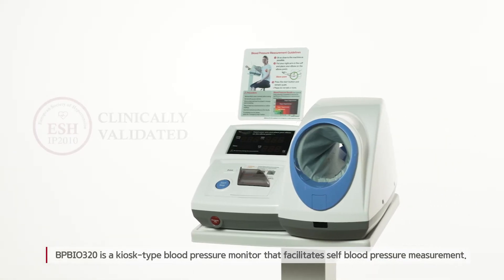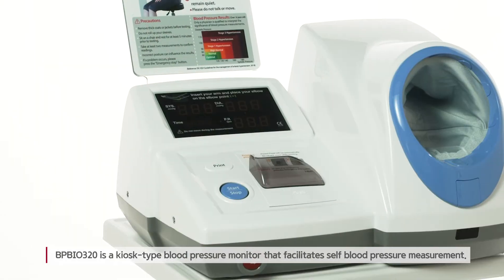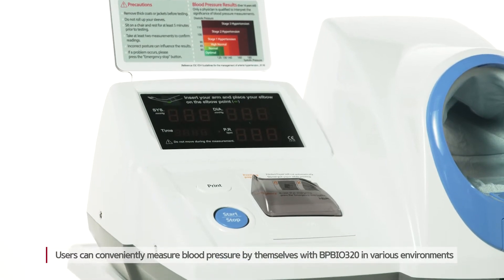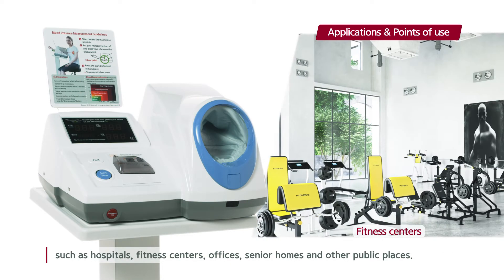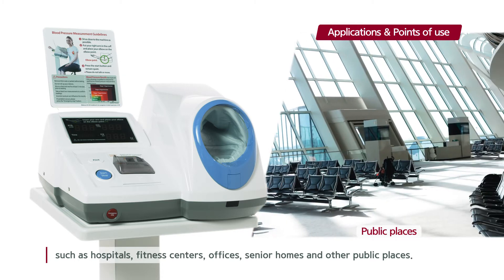BPBio320 is a kiosk-type blood pressure monitor that facilitates self-blood pressure measurement. Users can conveniently measure blood pressure by themselves with BPBio320 in various environments, such as hospitals, fitness centers, offices, senior homes, and other public places.